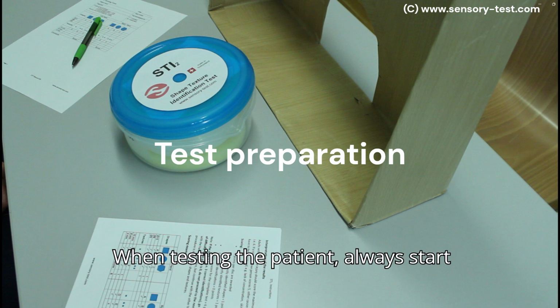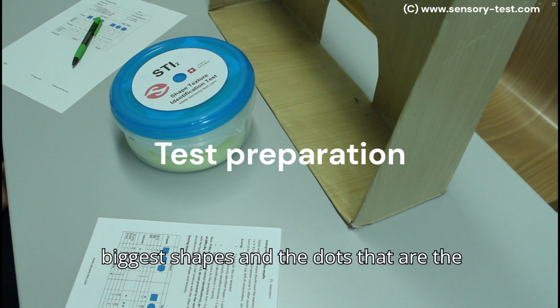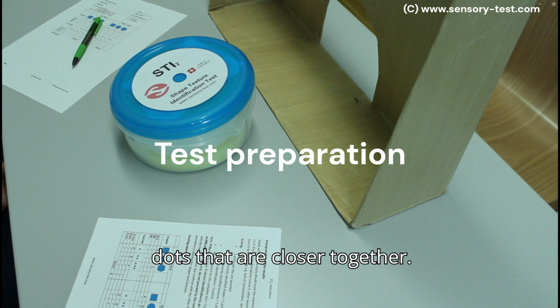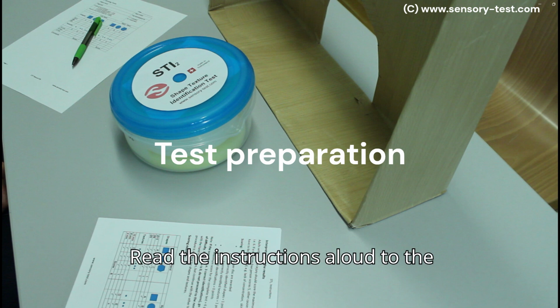When testing the patient, always start with the uninjured hand. Always start with the disc containing the biggest shapes and the dots that are the furthest apart. Continue with the smaller shapes and the dots that are closer together. Always make sure that the test is performed in the same way, that is in the same order, and with the same instructions, in order to ensure standardization. Read the instructions aloud to the patient.